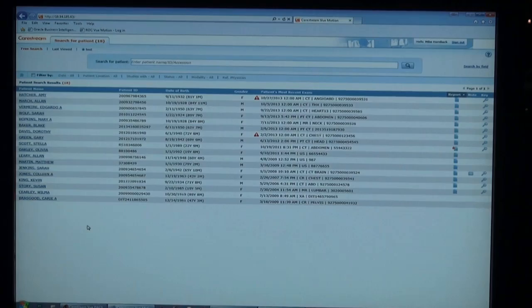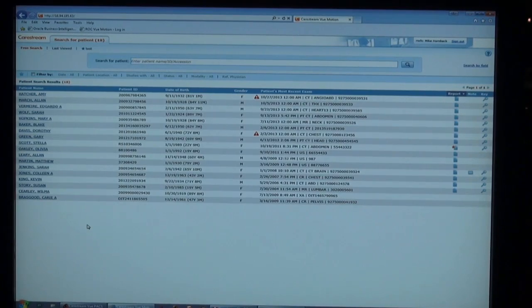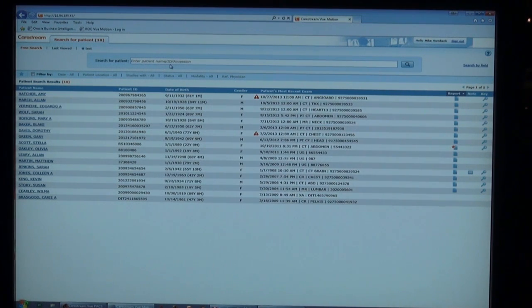Michael Hornback with CareStream Health introducing the latest version of Vue Motion, our zero-footprint viewer for referring physicians and clinicians. Once logged into Vue Motion, the referring physicians and clinicians have access to patients based on their permissions granted by the imaging department. They can search for a specific patient by name, ID, or accession, or filter by any number of criteria.